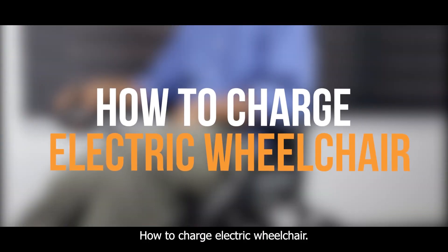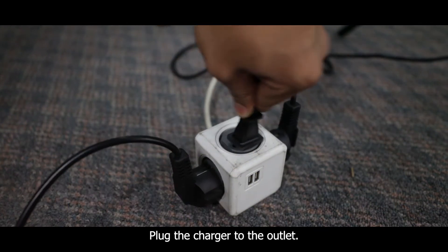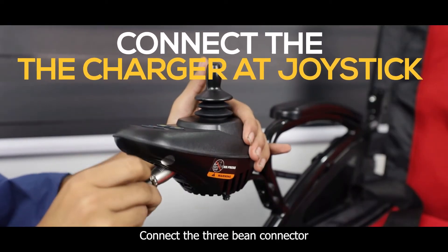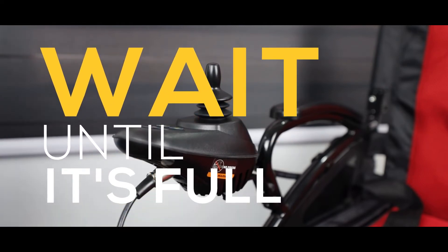How to charge the electric wheelchair? Plug the charger into the outlet. Connect the 3-pin connector to the joystick. Then wait until the battery is full.